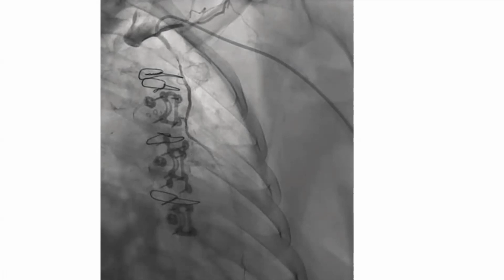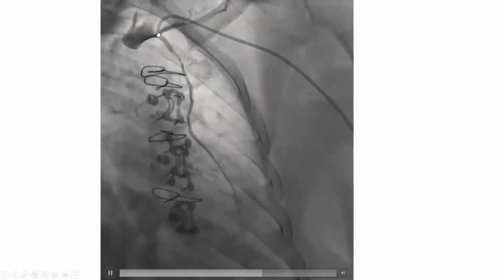We had to push the guide in. So there were a lot of in and out movements of the guide, and that was one of the reasons for that dissection. So: non-coaxial guide, a lot of in and out movements, plus contrast injection on a guide that's not coaxial. Even though we never were damped at any time, we still got a dissection, unfortunately.